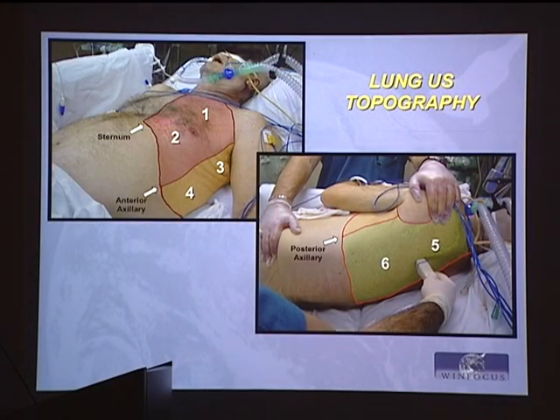What about the technique? You see that essentially lung ultrasound is a surface technique, because if the lung is full of air, like physiologically it is, air is a barrier for ultrasound, so you cannot see from one side to another of the lung like with X-ray, but you need to explore the lung on all the surfaces, okay?